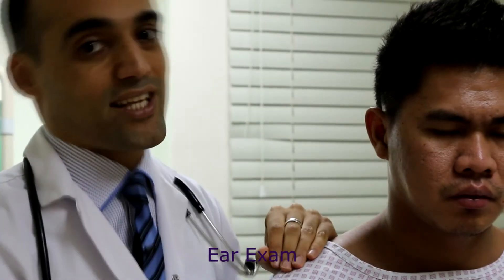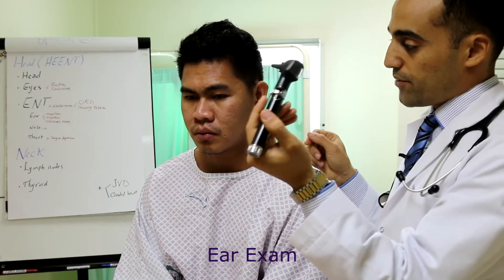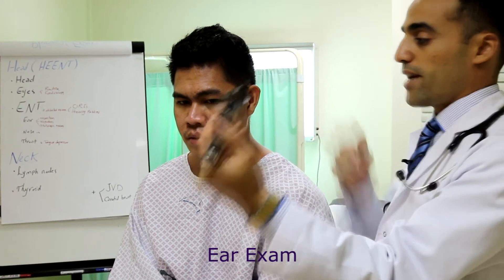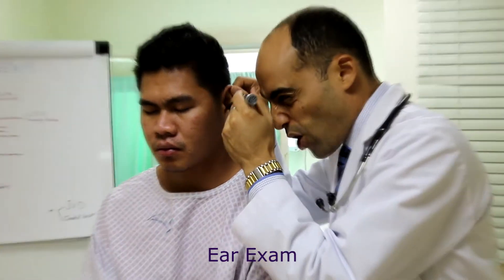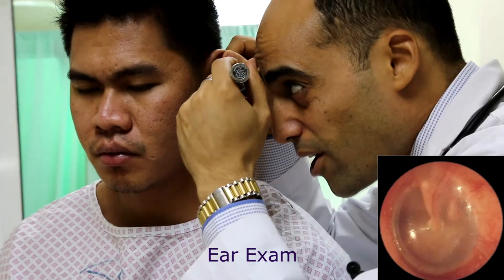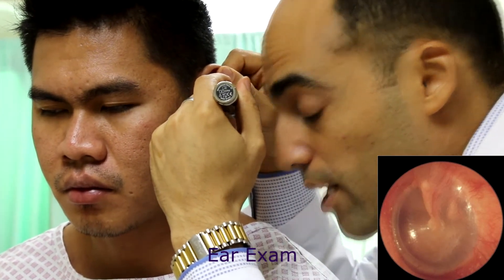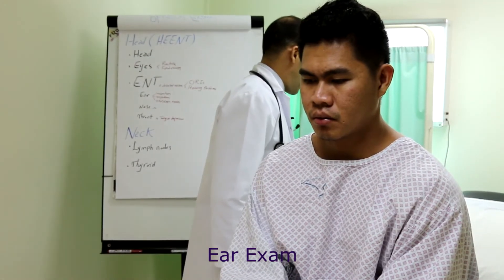This test is a little painful, so do it very gently in the clinical examination. Also consider that patients are exposed to many ear examinations in the clinical skills examination. When examining the left ear, stand on the left side of the patient, hold the otoscope with your left hand, straighten the ear pinna up, and introduce the otoscope very gently. I'm seeing now the tympanic membrane and the cone of light.